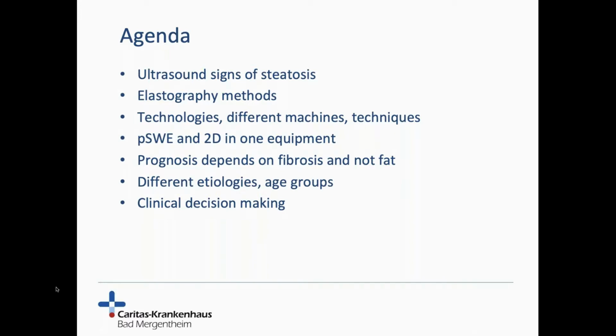I will introduce elastographic methods, go through the technologies of the different machines and techniques. I will compare results of two techniques in one equipment. Finally, one of the take-home messages is mainly that prognosis depends on fibrosis and not on the fat amount.